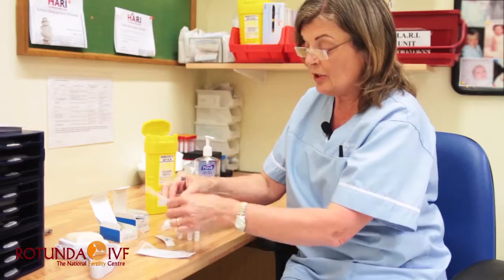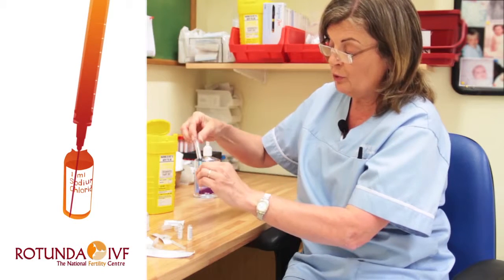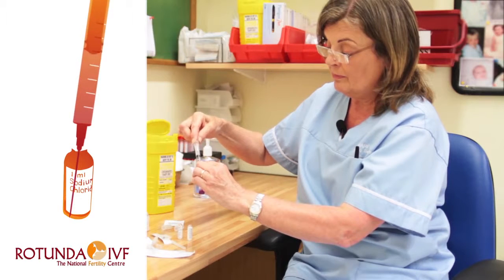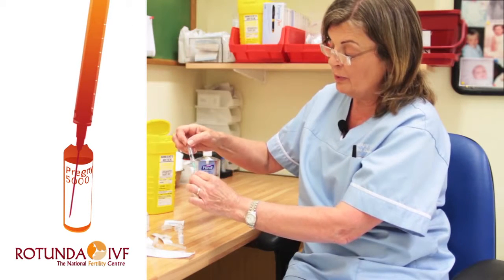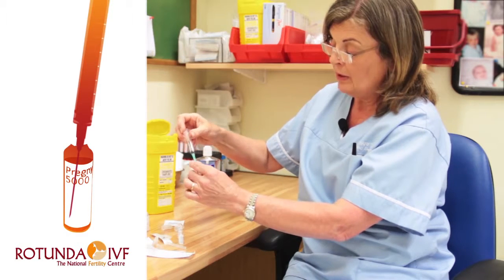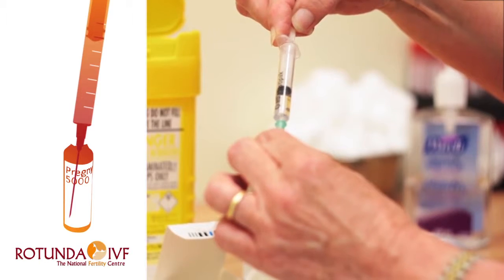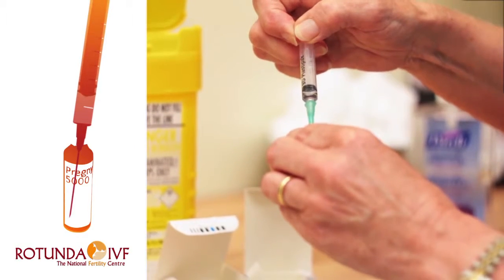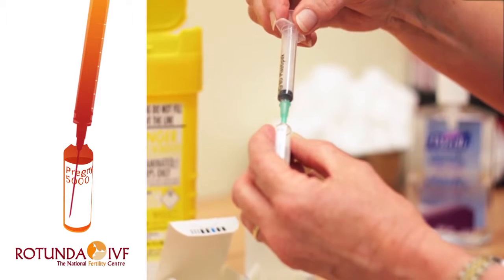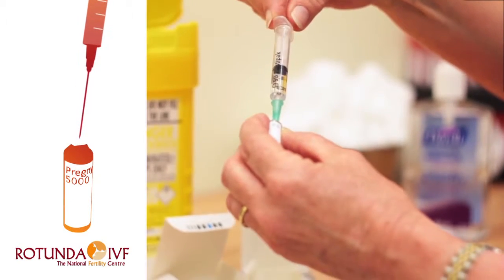Take your syringe and attach the long needle. Take the sheath of the needle and load the 1 ml of fluid into the syringe. Push this fluid into the first powder, the vial of powder. Now, this has dissolved instantly, so reload this into the syringe and inject it into the second ampoule of powder. Again, this will dissolve instantly and you can reload it into the syringe. You now have 2 powders with 1 fluid mixed in the syringe.